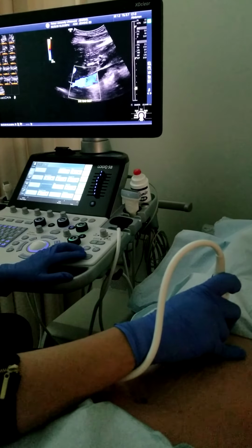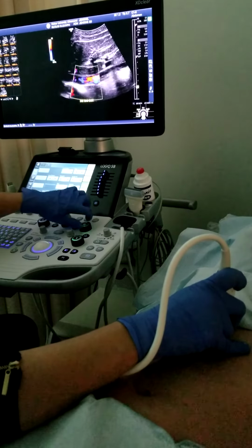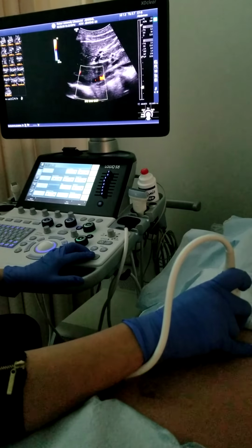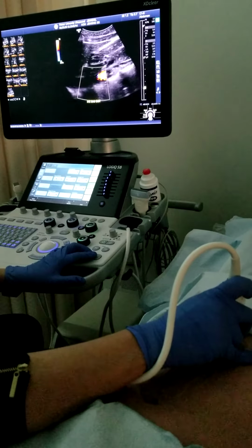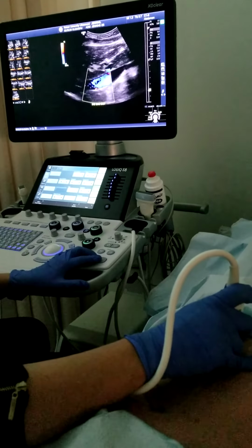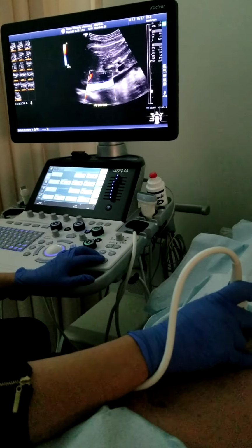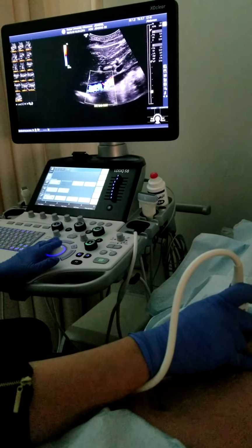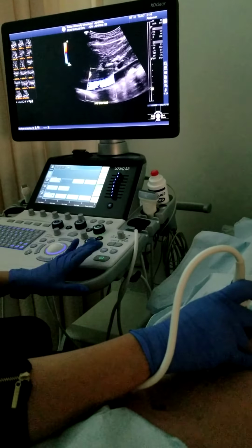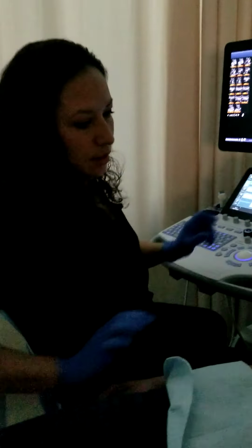Take a little breath in, like half a breath in and hold it. So see how her breathing in compressed that vein. So if I have all my settings ready, and then I let her breathe, go ahead and breathe. Of course, it didn't work the way I wanted it to. Ideally, it would have filled in that vessel. That's okay, breathe normal. Okay, that's pretty decent. IVC sagittal. So that is the end of the aorta IVC protocol on a normal patient.